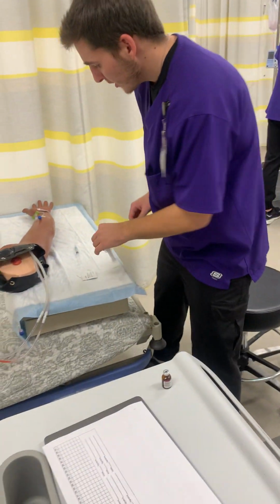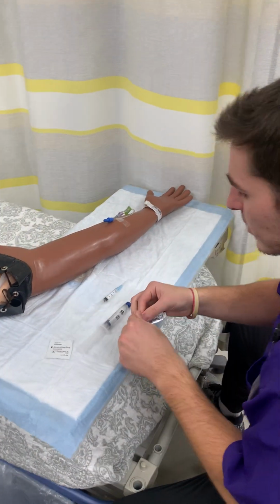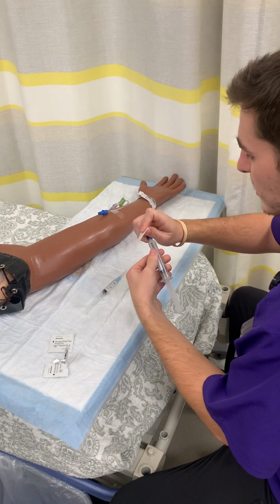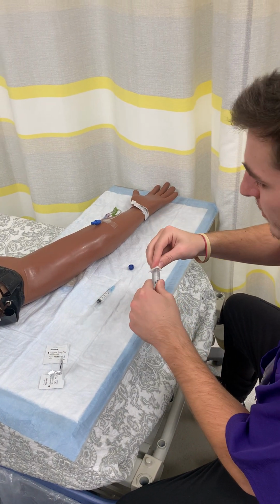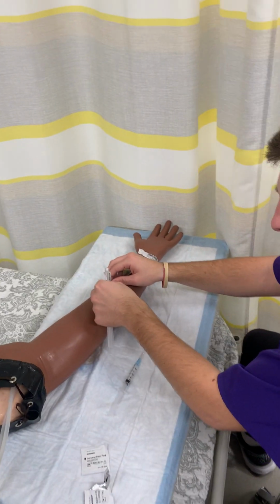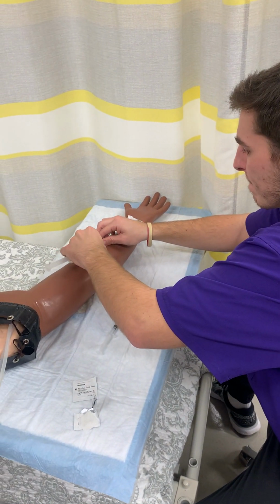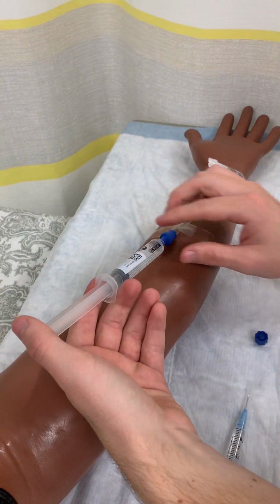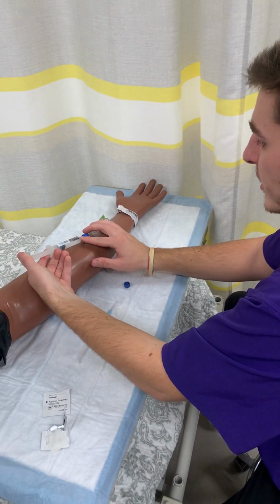So now I'm just going to open this up, and I'm just going to scrub this top. I'll do this for 15 to 30 seconds, as well as I'll scrub this top, 15 to 30 seconds as well. Now this is just to make sure I'm flushing the tube, and I would give about 3 milliliters.